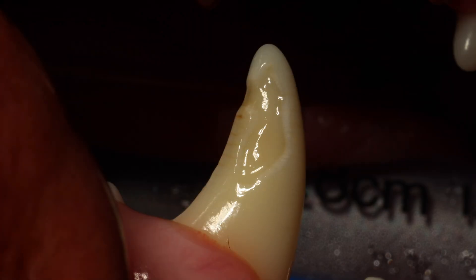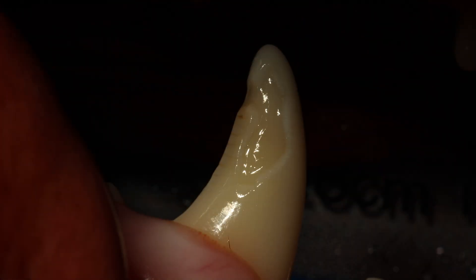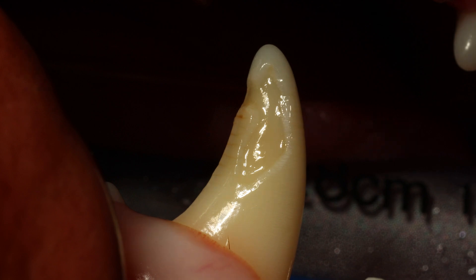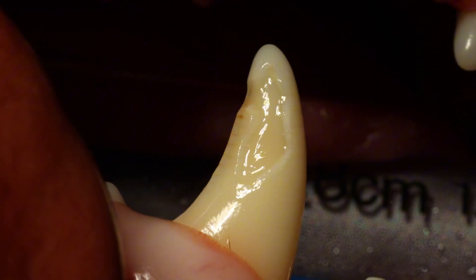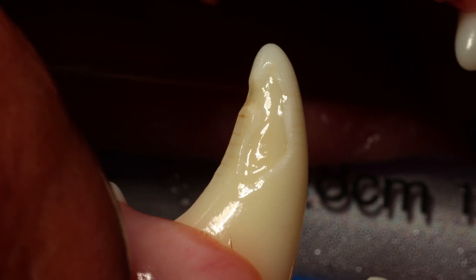You just want to rub it in really well, preferably for around 20 seconds. Then you use your 3-way syringe and flush with air to make this layer as thin as possible. Then you light cure. Depending on the output of your curing gun, usually it is around 10 seconds for most veterinary light guns, though some of the more powerful ones are only 3 seconds.